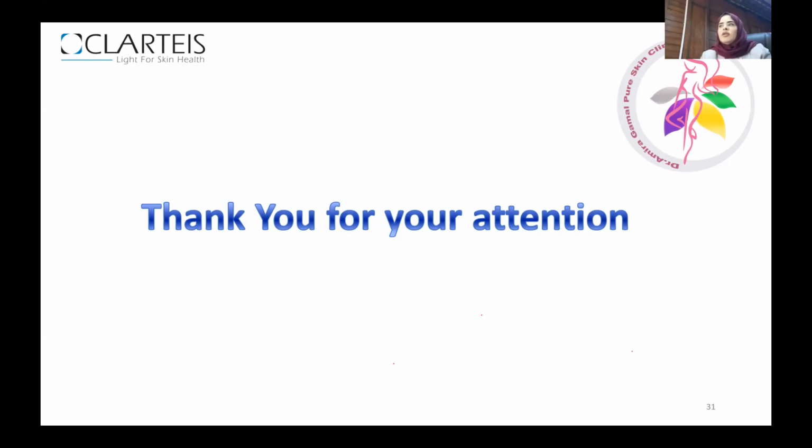Is it safe for pregnancy and breastfeeding women? Listen, we go away from pregnancy. Lactating, it's okay, no problem with lactation. For pregnancy, I know it is safe, but I'm not doing it for pregnant women. We agree with you, because one of the contraindications of Exciplex and Excimer light is pregnancy. So we don't recommend using Excimer in pregnancy.